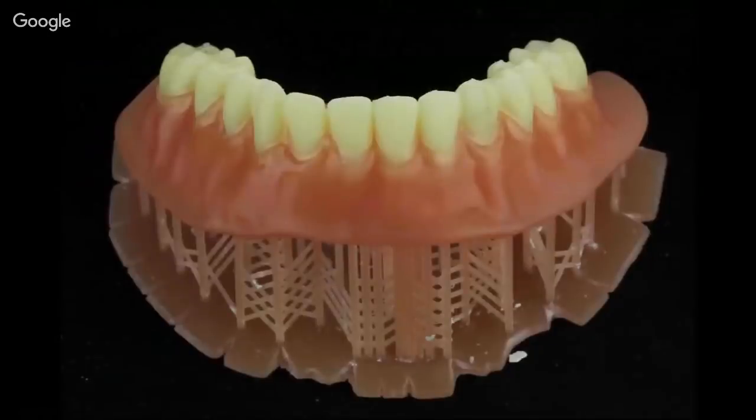So here's what I've done: I've printed the base material out of NextDent base. It's still on the supports. And then I also printed the teeth themselves out of the NextDent crown and bridge material. Bonded those together, and this is now, for all purposes, a monolithic denture, even though it's 2 different materials. Remember, these are similar materials, composite, chemical makeup, and so these have an incredible bond to one another.